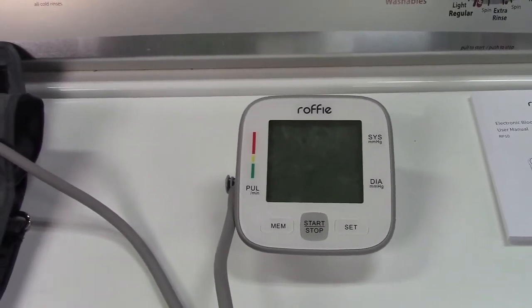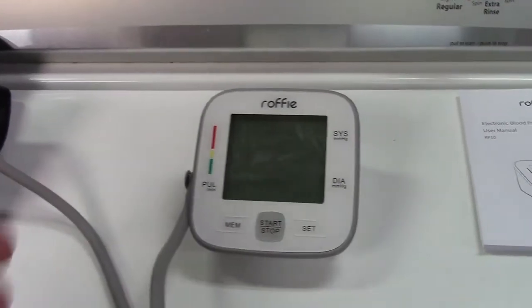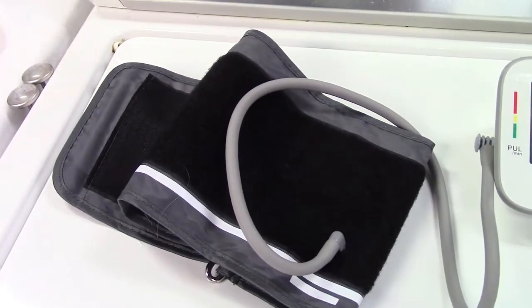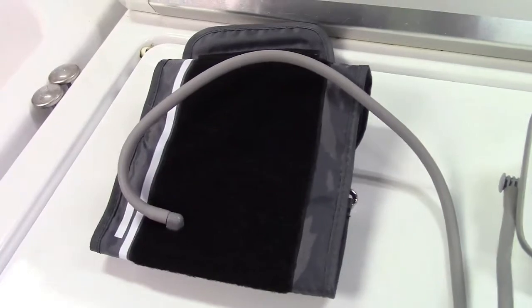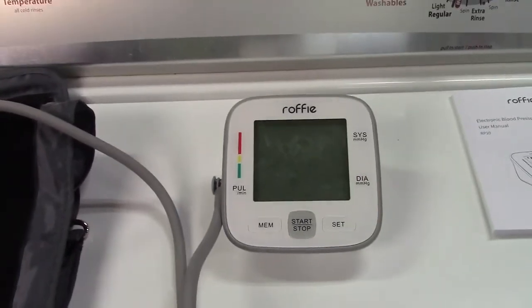It works very well, just like any other blood pressure monitor I've tested. The screen is very easy to read. The cuff is adjustable from 8.6 to 16.5 inches, so it will fit a variety of people without much trouble. All around it's a very good blood pressure monitor — it definitely does its job.